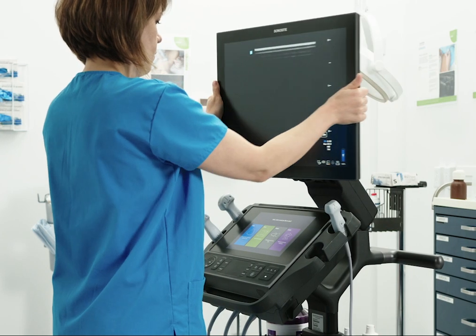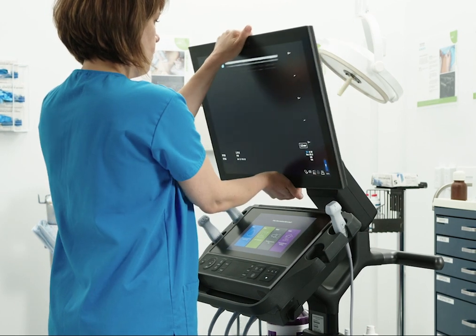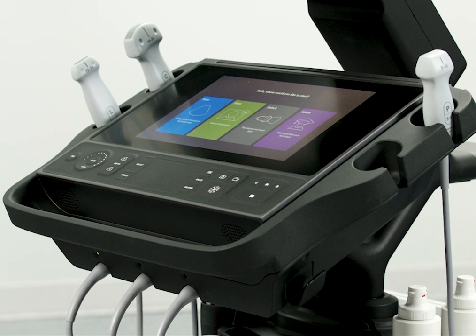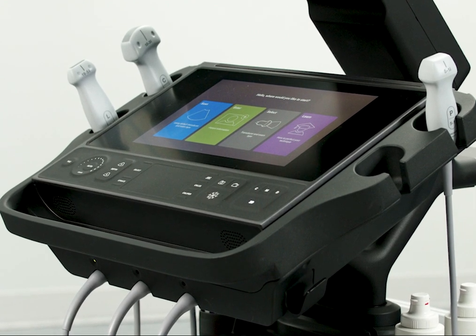You can adjust the position of the monitor by moving the adjustable monitor arm. The system also has a touch panel that can be used to navigate to different screens and features.